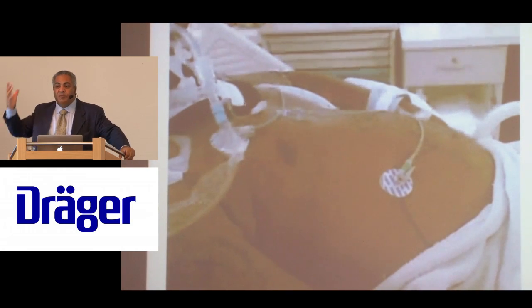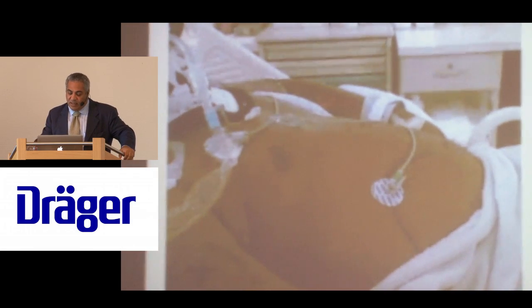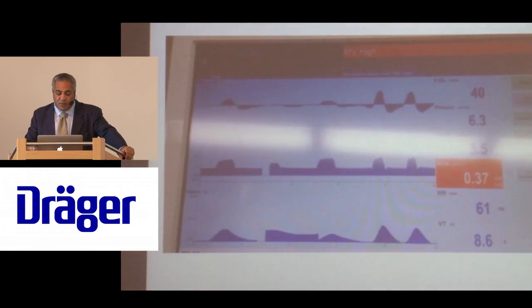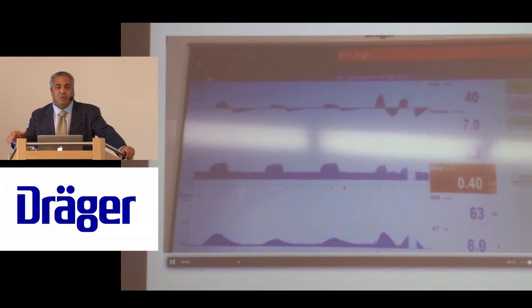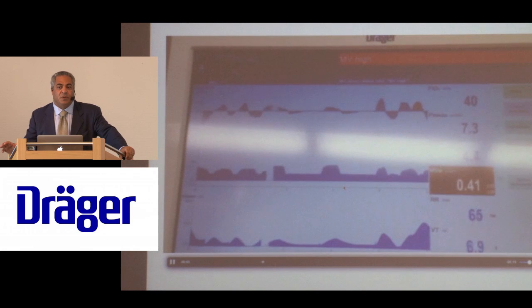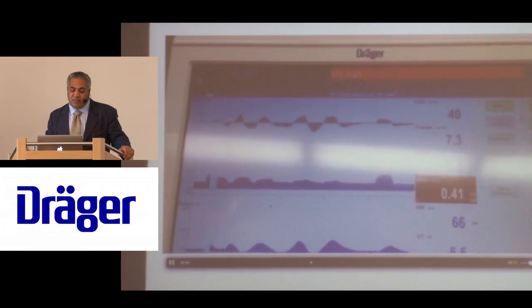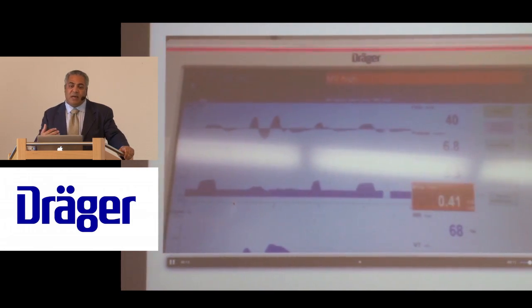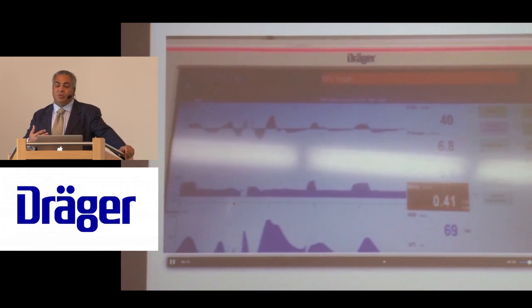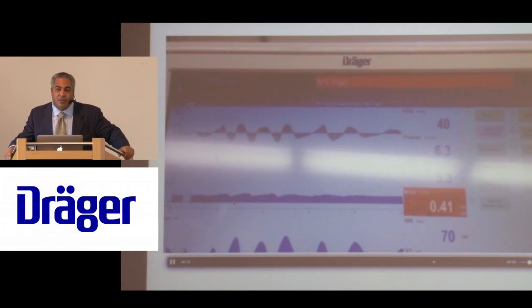So of course, you can remove both hemispheres, the patient will still breathe and have distress. And this is why we can't really do away with this. This is what I was talking about. You'll see that the patient, if you use PRVC or autoflow, the airway pressure can become quite low. The patient's actually on CPAP here. You can see they're pulling the airway pressure down because of the algorithm: if the patient moves a certain volume, then the machine is not going to add additional pressure.